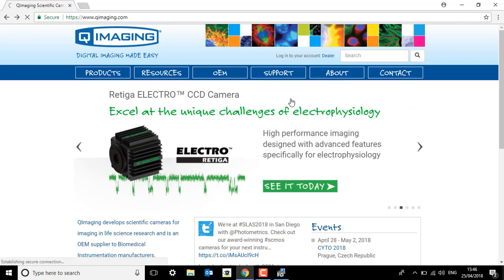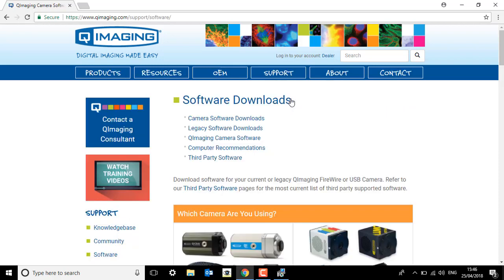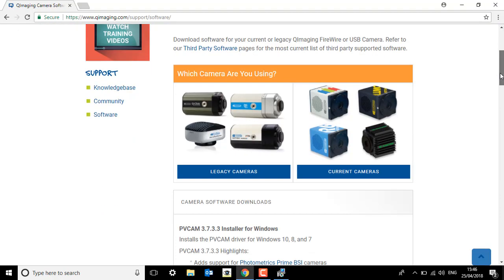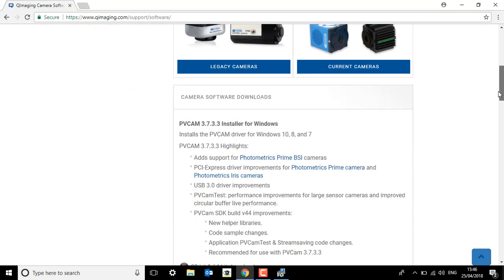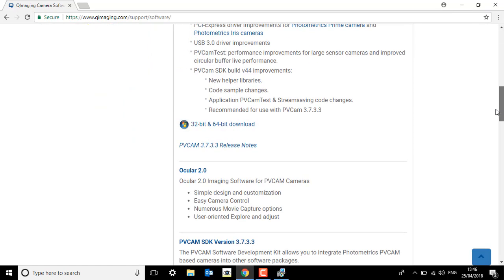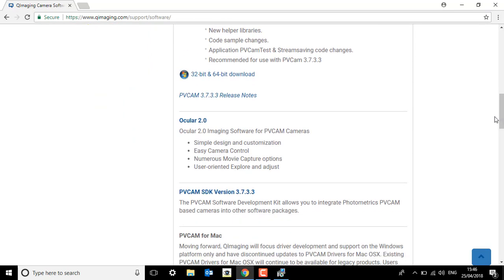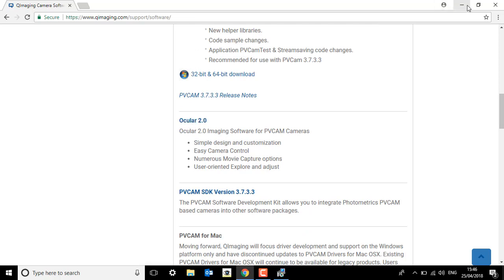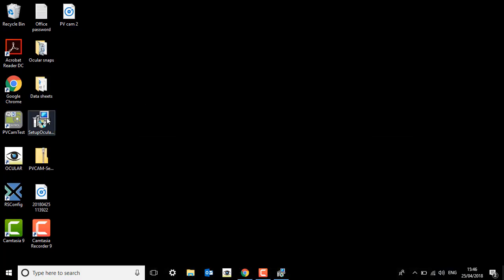So once you've clicked that, if you scroll down and after PVCAM you'll see a link for Ocular. You click Ocular 2.0 and you'll download the setup wizard for Ocular.